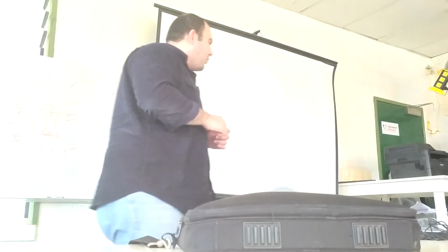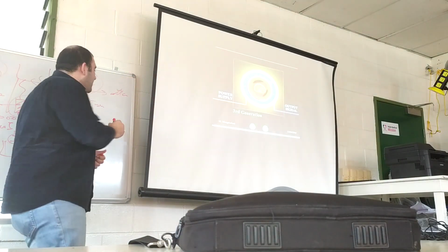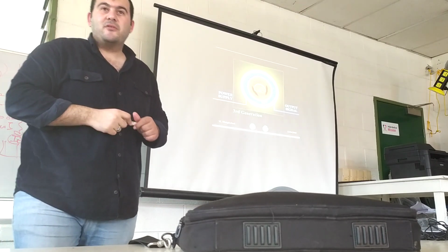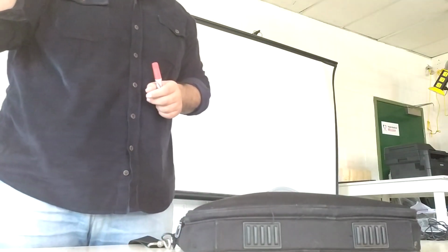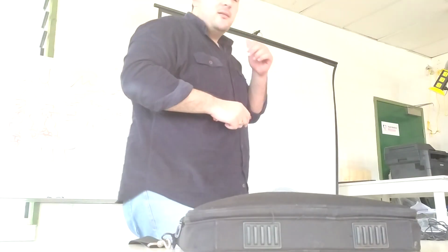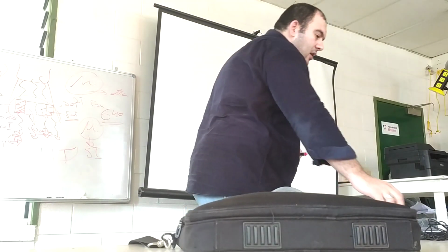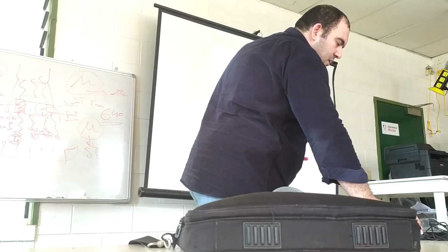Sometimes we now have the number of rows of detectors reaching 640, around 600. Previously you had one row of detectors, then 4, then 16. When you increase the number of rows of detectors, you can cover a larger area of the patient at the same time. In less than 1 second, you can scan a patient for CT brain. This is the most common generation, third generation, which we use here in our hospital.